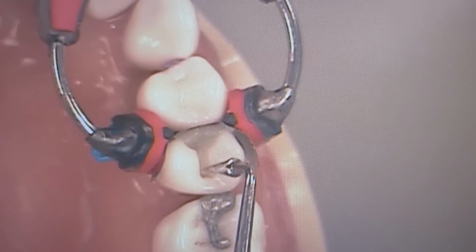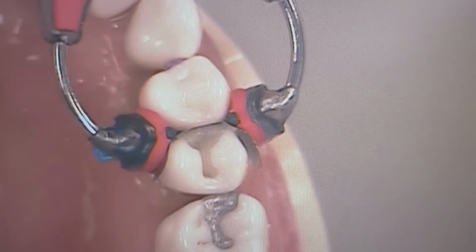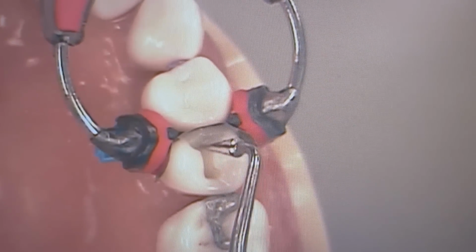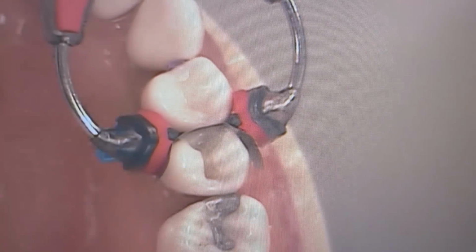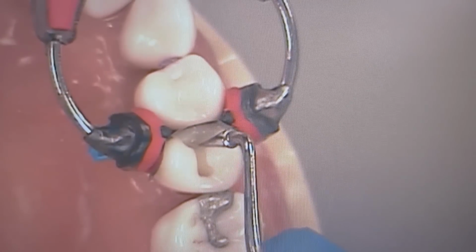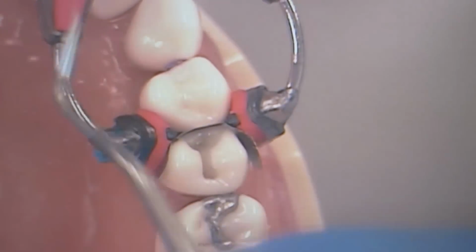So Dr. Chui, if we were able to look along the occlusal plane, is the tip of your instrument just resting right on the anatomy? I'm just resting it right on the triangular ridge. Okay. So resting the tip of the instrument on the triangular ridge. I'll remove as much of the composite as I can.